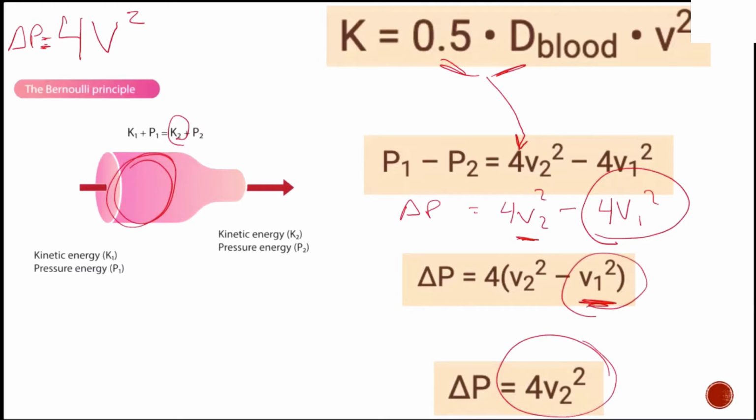So remember that if you have something like tricuspid stenosis or pulmonary stenosis, we have to account for those later in our calculations, and I'll show you how to do that, right? But normally, we just care about the maximum velocity because it's so much bigger than V1, all right?